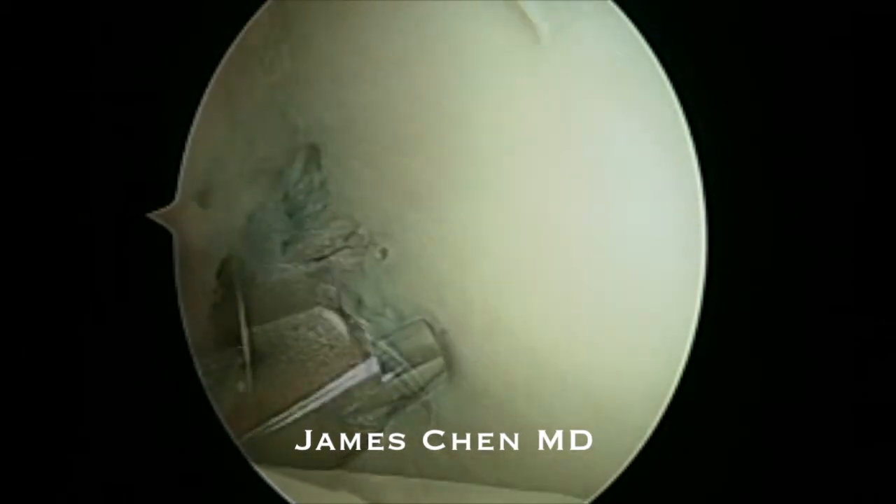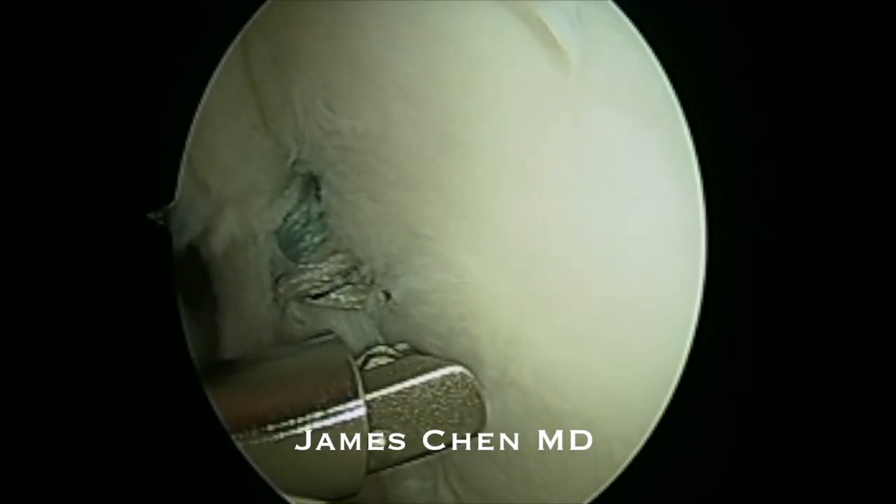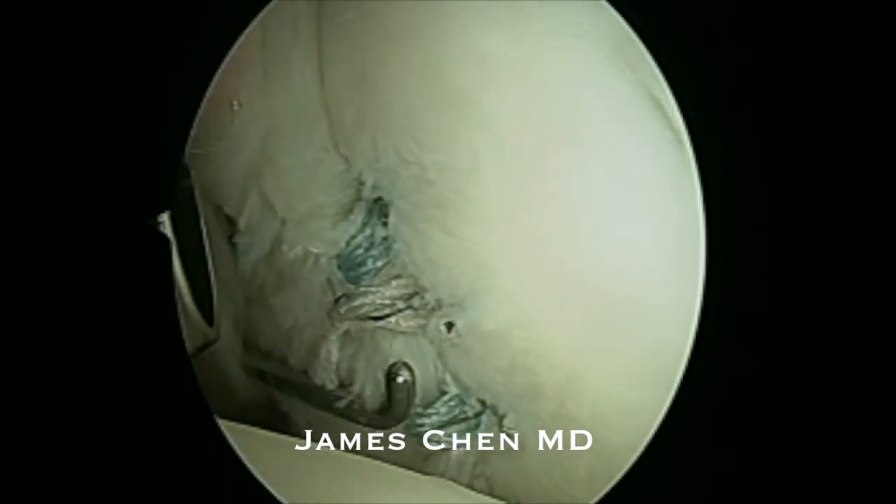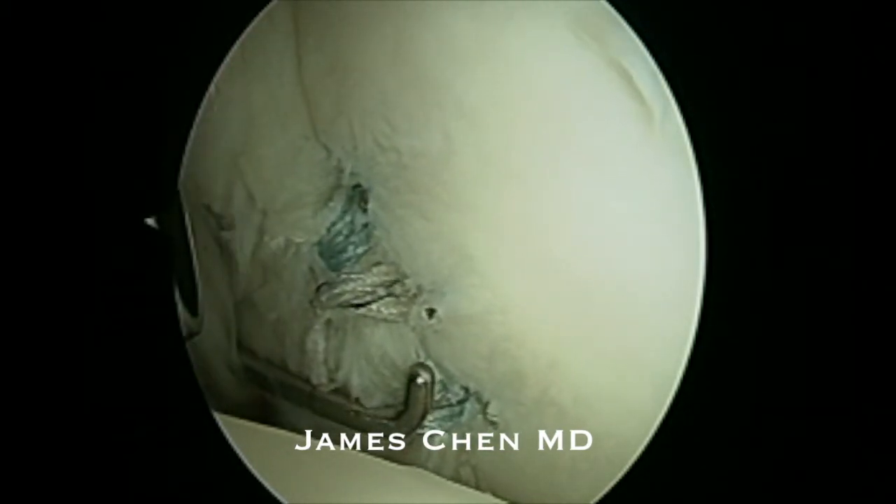I then cut the suture and then probe the repair, and you can see it is a very snug repair of that posterior labrum.